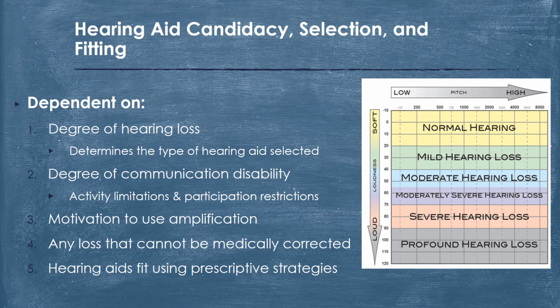So, for example, if I had a patient who had a hearing loss at 1000 hertz of about 40 dBHL, I want to get them close to the normal hearing range, so I need to improve their hearing by 20 dB, or give them 20 dB of gain to get them close to the normal hearing level.